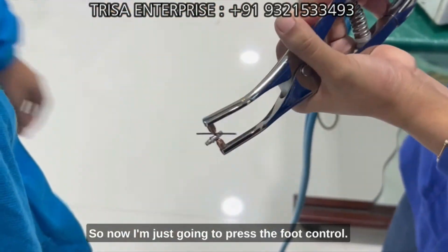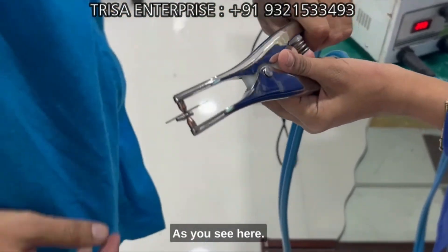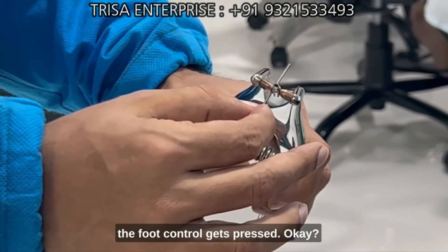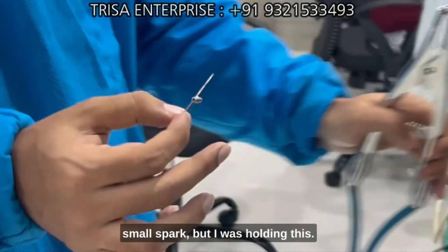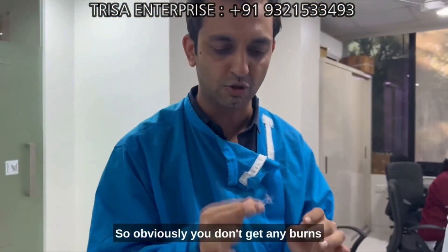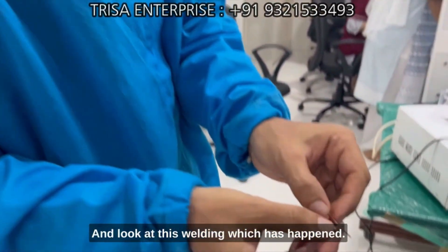I'm going to press the foot control, as you can see here, while holding this wire. As the foot control gets pressed — there was a small spark, but since I was holding the wire, you obviously don't get any burns or injury.